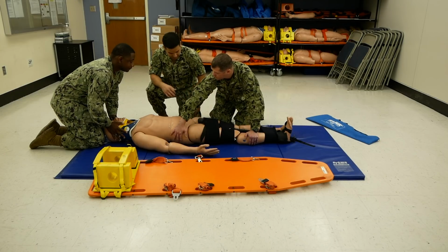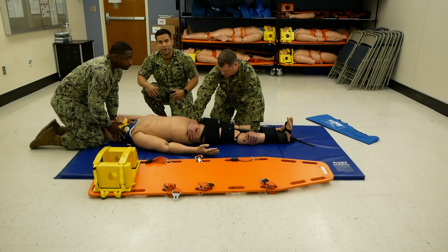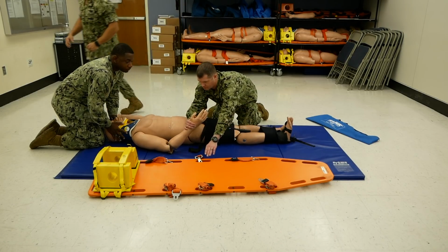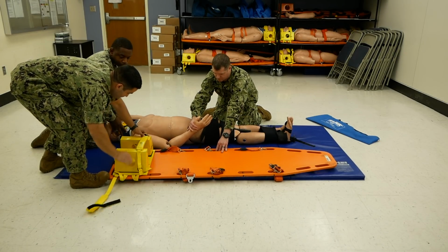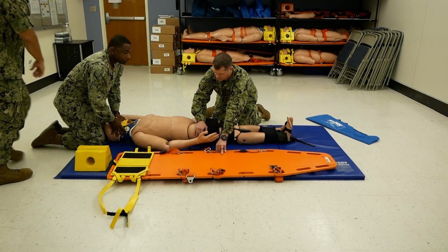Before you do this, make sure you lift the arm on this mannequin just for the ease of the mannequin to come over. And also prepare your spine board. So go ahead and prepare your spine board by removing the head blocks, so nothing is interfering as you place the patient on the spine board.